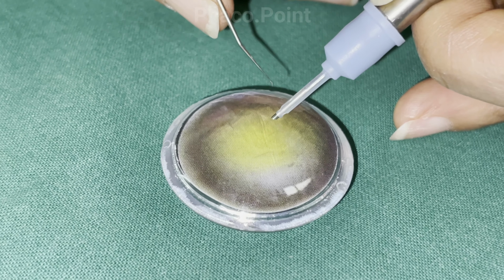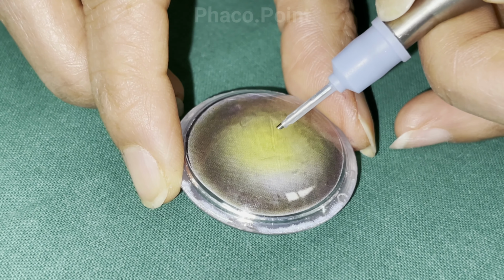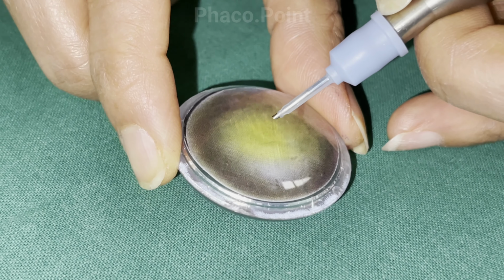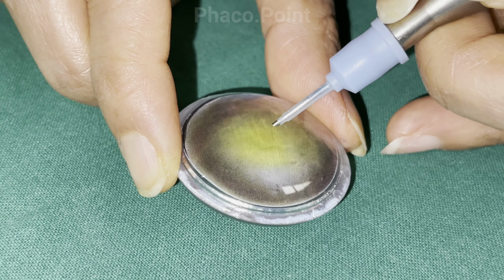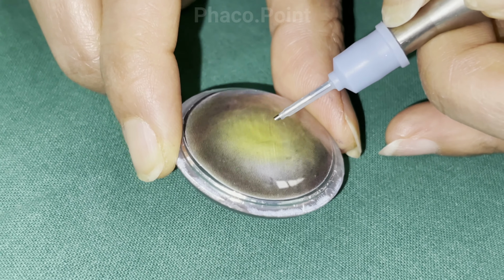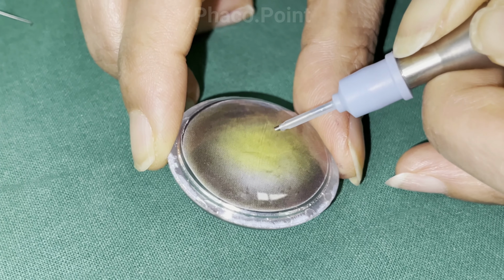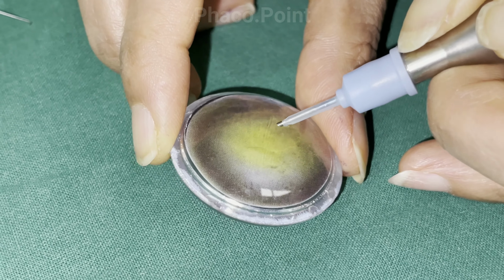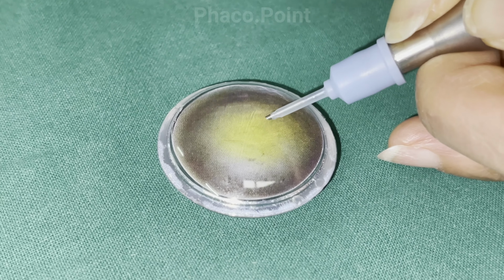Now, how do you know you've got a good hold of the nucleus? When you have successfully impaled the nucleus and reached the depth that you want, you go back to foot pedal 2 and elevate the probe. As you elevate the probe, you will see that the nucleus also starts to lift up. This upward movement of the nucleus with elevation of the probe suggests that the nucleus is properly impaled.